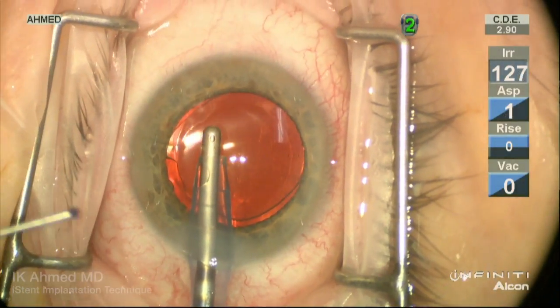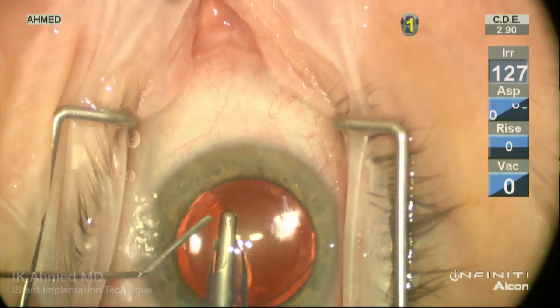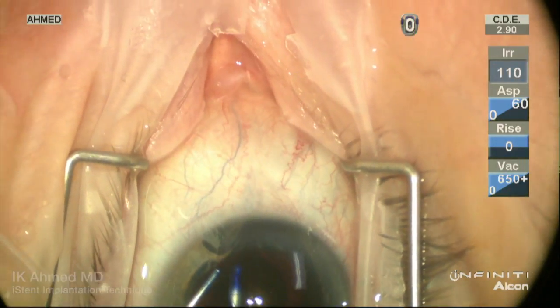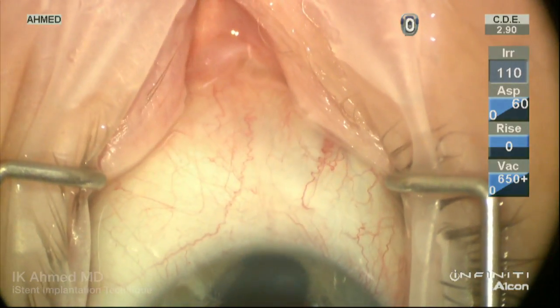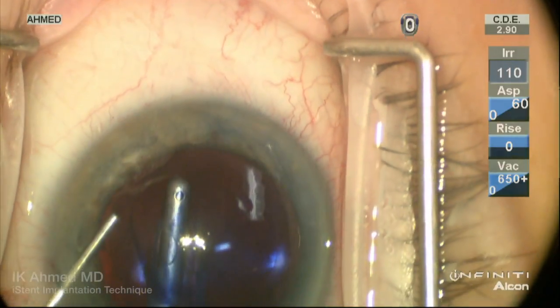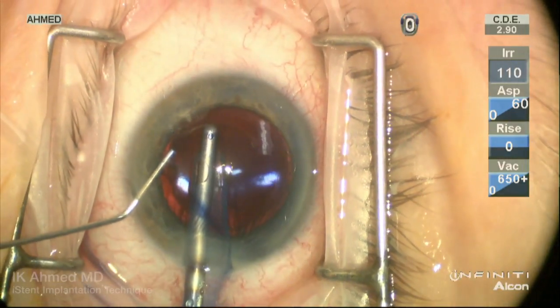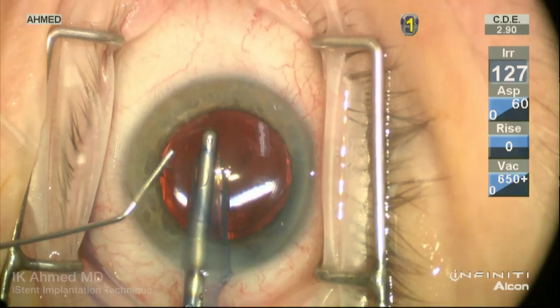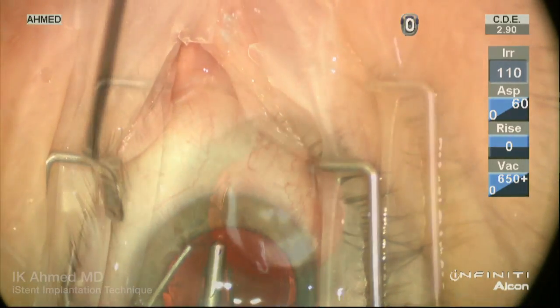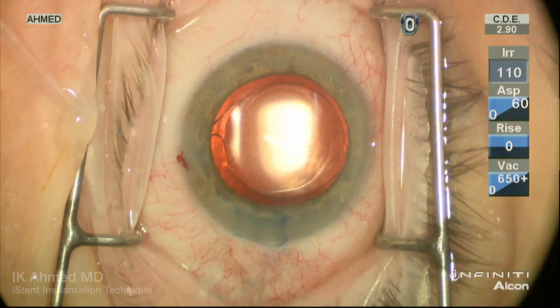Towards the end of the case, irrigation and injection of trypan blue nicely shows the distal outflow passage. Note the three implants have been placed nasally, and we can see a nice pattern of filling of the episcleral vessels here nasally, superior and infranasally, alternating with blanching with the irrigation from the eye handpiece. This pattern is only present in the area nasally where the implants have been placed, and is not present temporally.